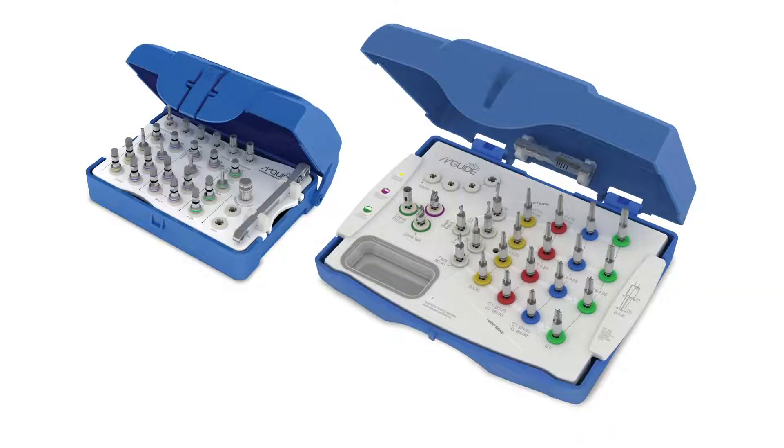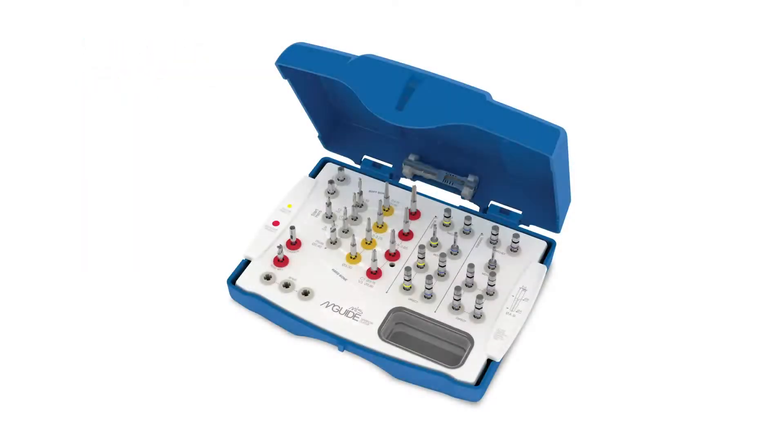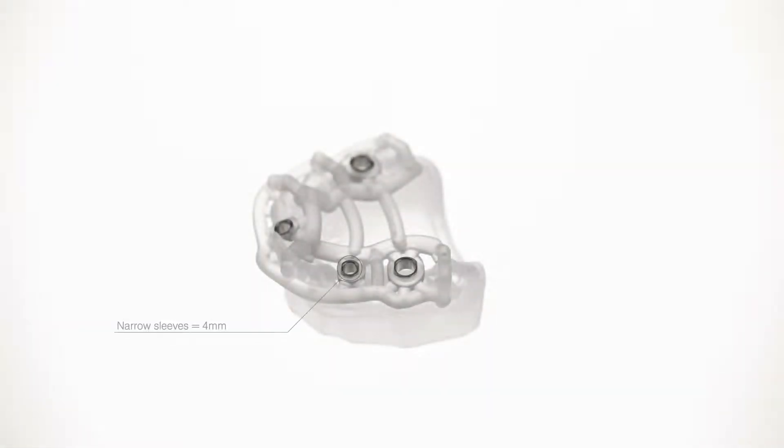Here we have the standard sleeve surgical set for the conical connection. It is used in procedures with implant diameters ranging from 3.3 to 5 mm. The narrow sleeve kit is used for placement of 3.3 to 3.9 mm diameter implants, in tight spaces where the standard set may be too large. The narrow sleeve's inner diameter is 4 mm, where the standard sleeve's inner diameter is 5.5 mm.